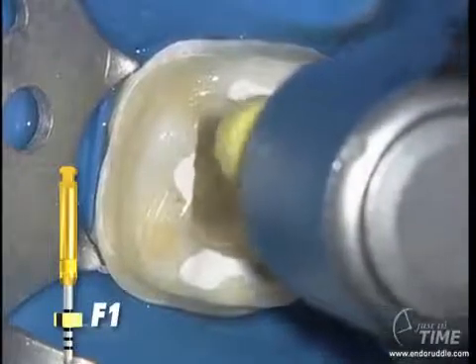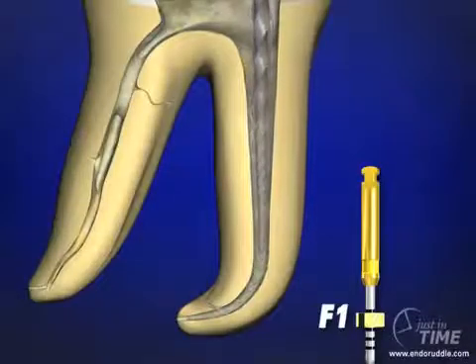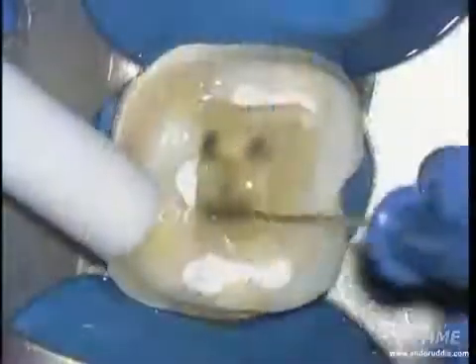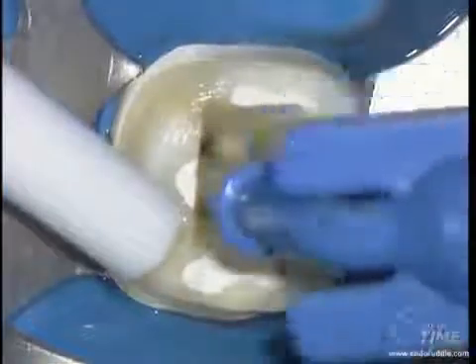The first finisher is a 20-07. It will generally go to length in one or more passes. When you remove the instrument, check for its apical flutes — if you see dentin accumulate in those blades, you can be confident that this instrument just cut its shape in the apical one-third. Upon removing the F1, irrigate to remove gross debris, recapitulate and confirm patency, and then re-irrigate.